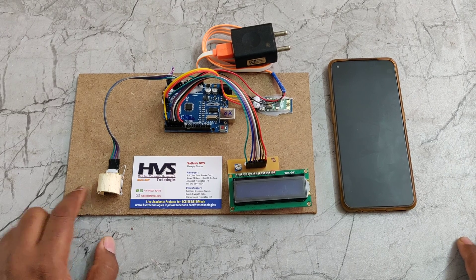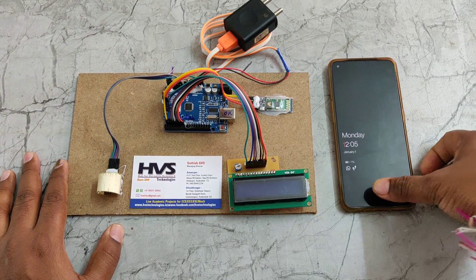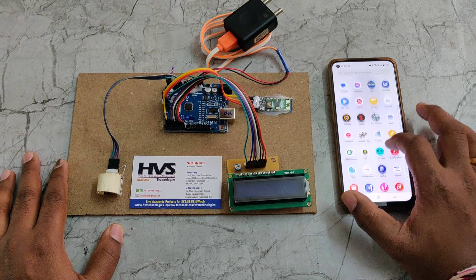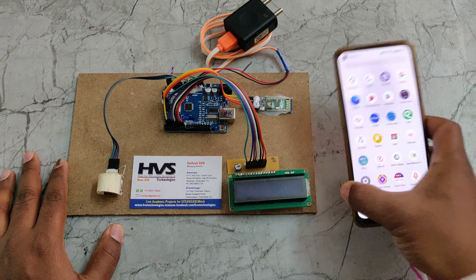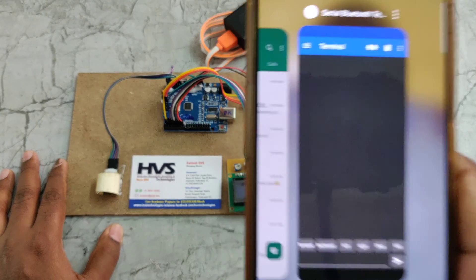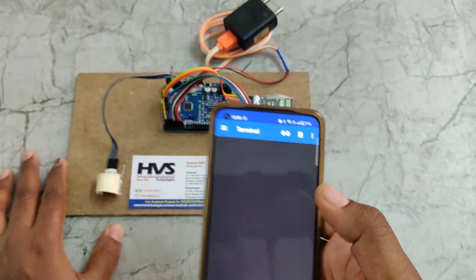The same data is also sent via Bluetooth using the HC05 module to an Android mobile phone. Before the demonstration, you need to install the serial monitoring application from the Play Store — this is the application's name and icon available there.